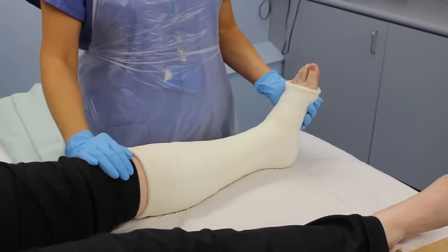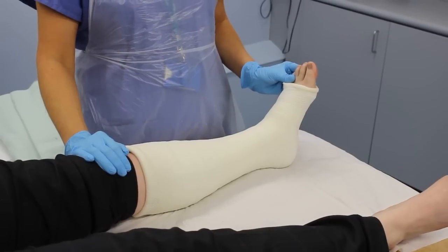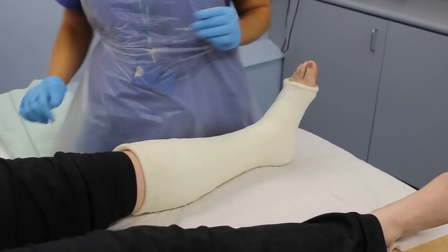Are the fingers, toes, or other joints exposed — swollen at all? If they are swollen and sensation is altered, seek medical advice. The cast may need simply easing or splitting.